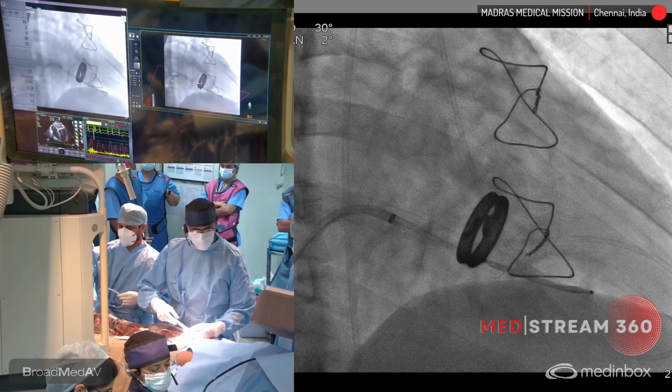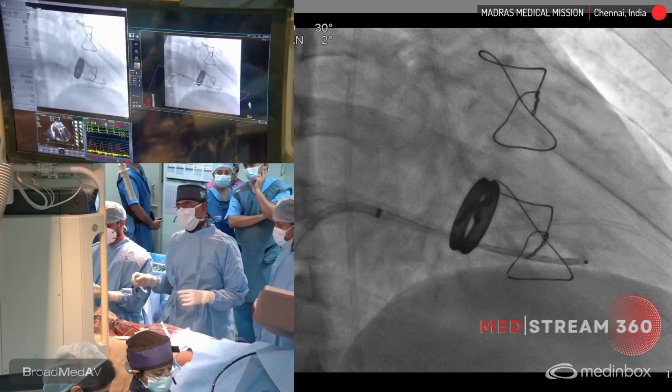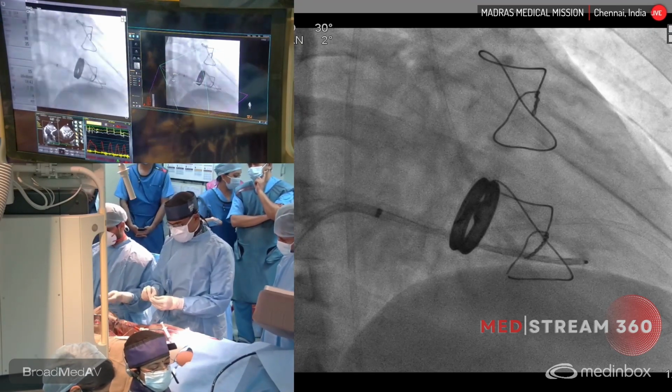Yeah, the 2D image is good. The 2D image was showing the two catheters. There are quite a few ectopics. The moment I get my retrograde vascular plug, this is flushed.